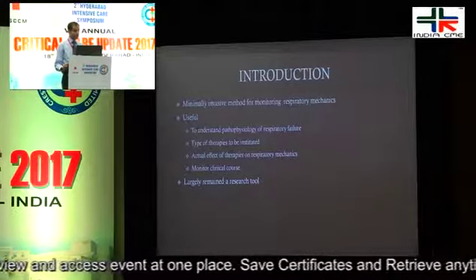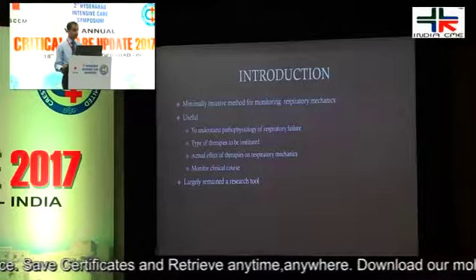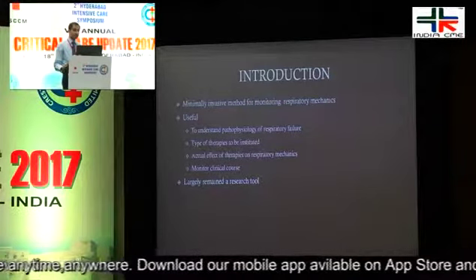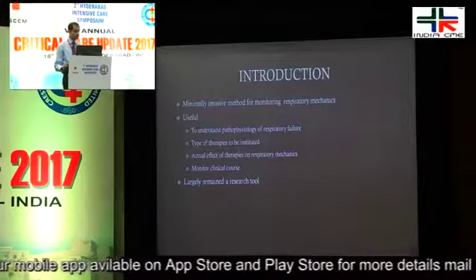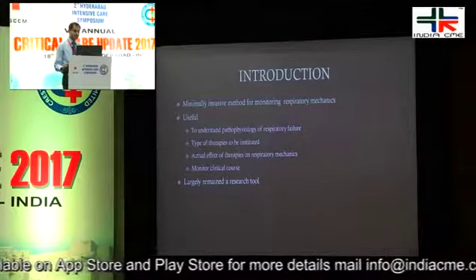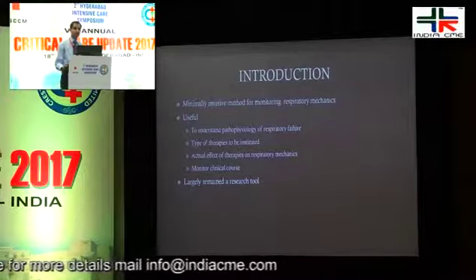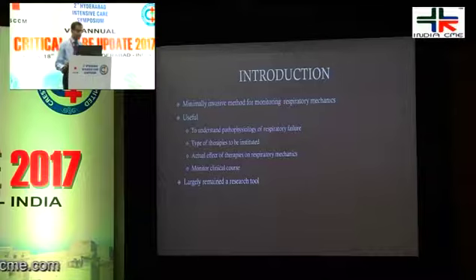It's useful to understand the pathophysiology of the respiratory failure, and if we are using esophageal pressure monitoring, the type of therapy that we need to institute, or whether we can personalize or individualize the therapy for a given patient, the effect of therapies on the respiratory mechanics, and to monitor the clinical course. So these are some of the 3 or 4 things that we try to assess with the use of esophageal pressure monitoring.